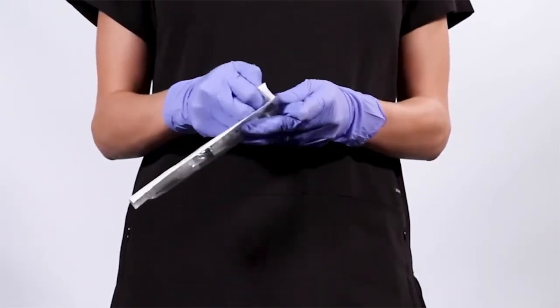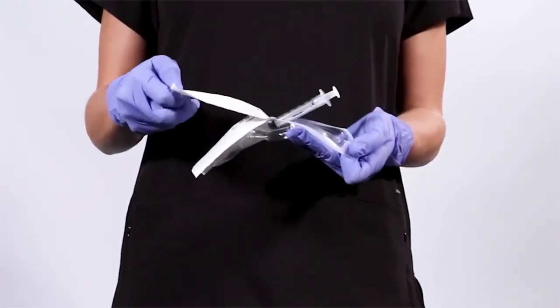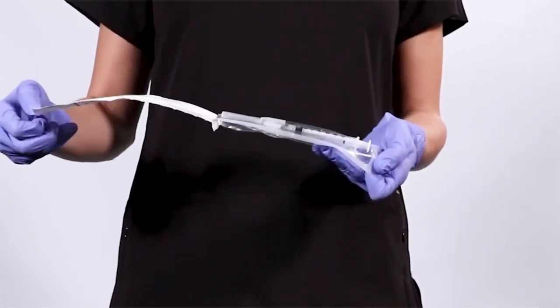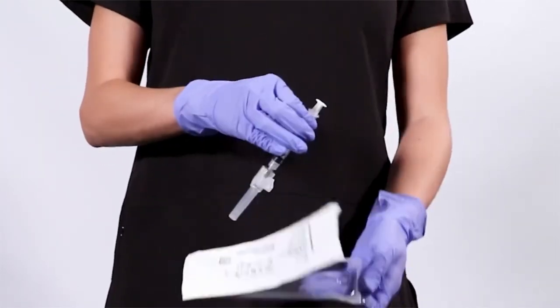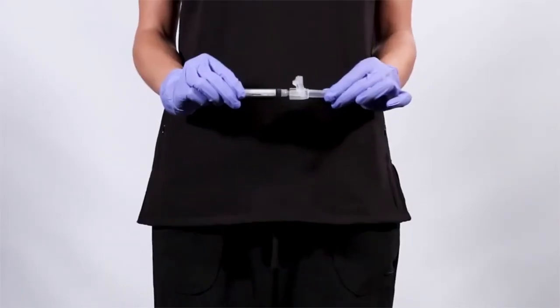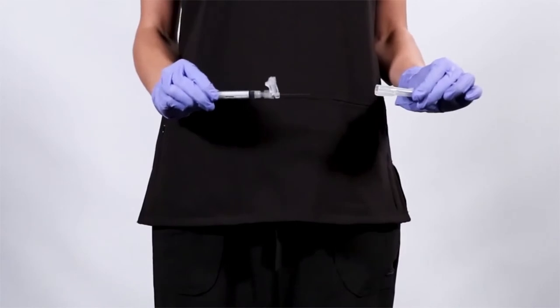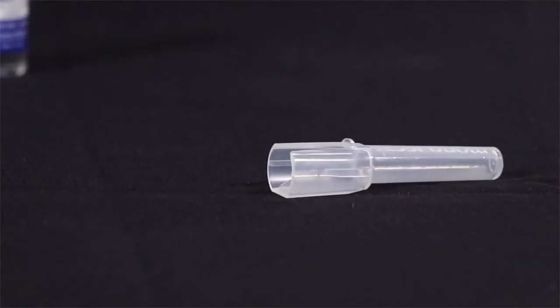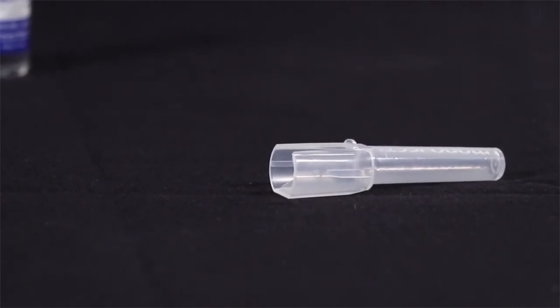Hold one thumb on the plastic tab and use your other thumb to carefully peel back the paper tab until the entire needle and cap are revealed. Remove the syringe. Remove the protective needle sheath and drop the sheath onto a flat surface.